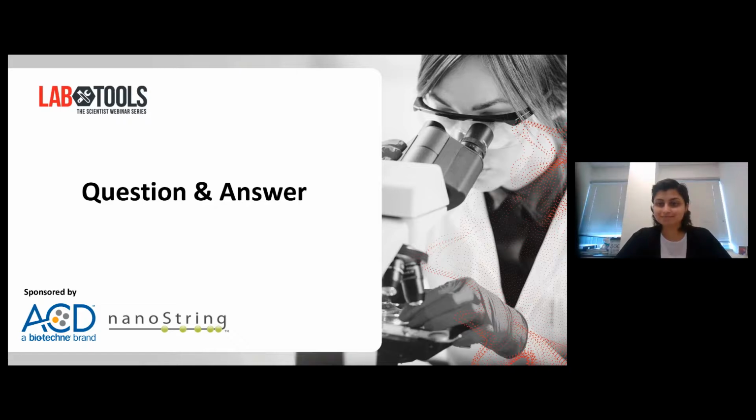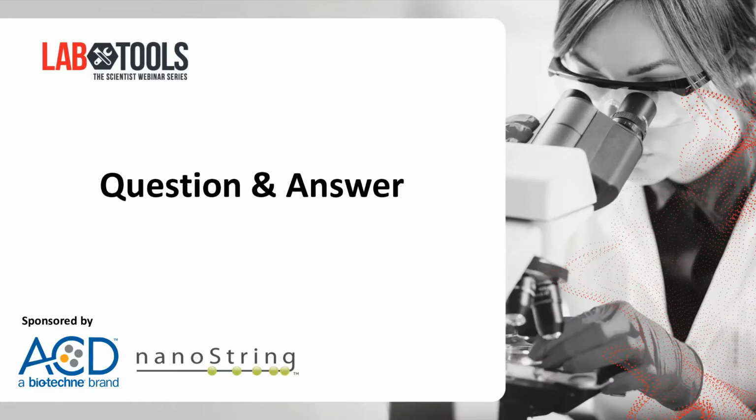Good. I believe we have time for one more question, and this will be for Kit. For GeoMx in the brain, is it possible to register brain sections to the atlas, and also to use atlas-defined regions to segment for transcript collection? Absolutely. So you can take those images that the Brain Atlas produces, that map out the different structural regions, and then use the overlay function to figure out which regions correlate to which ones in your tissue segment.